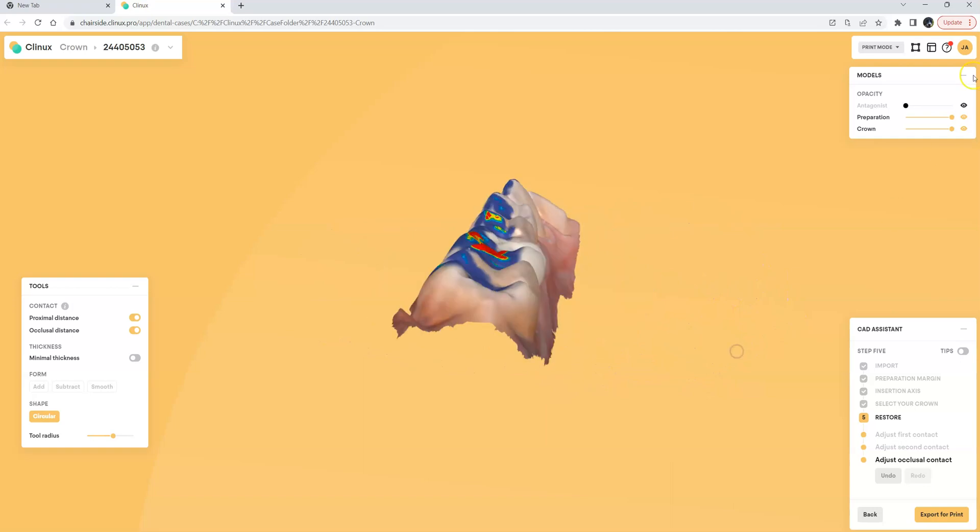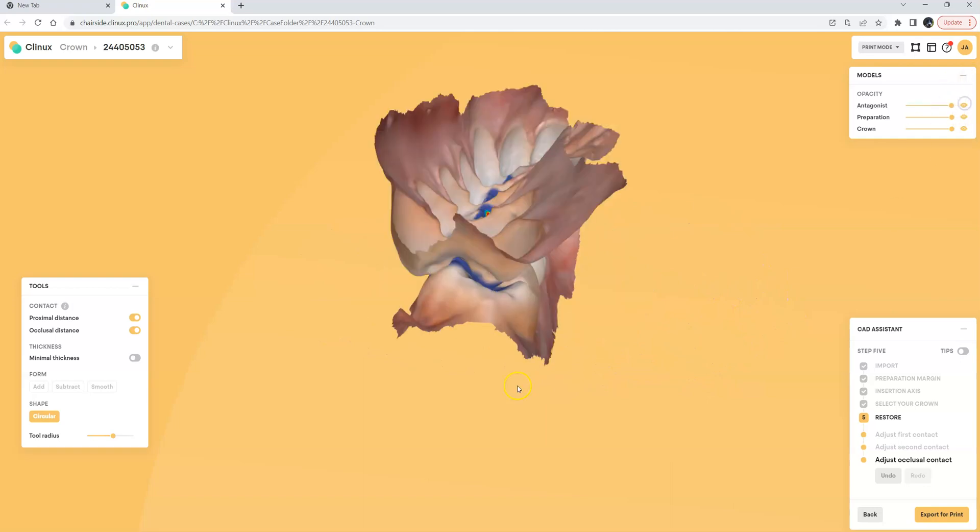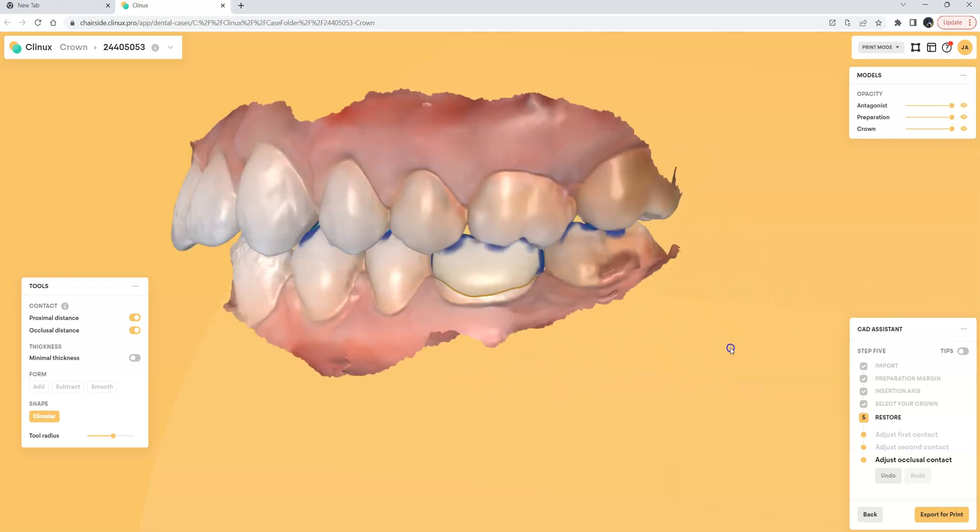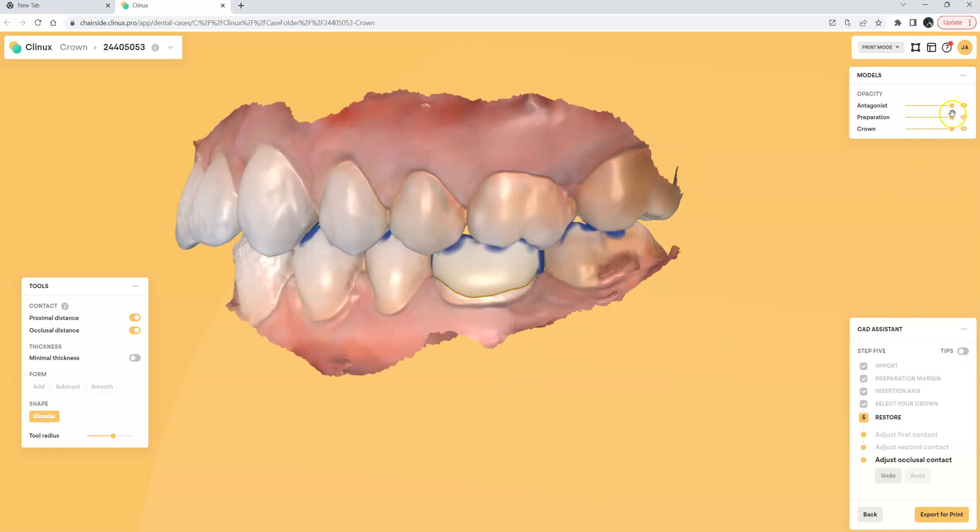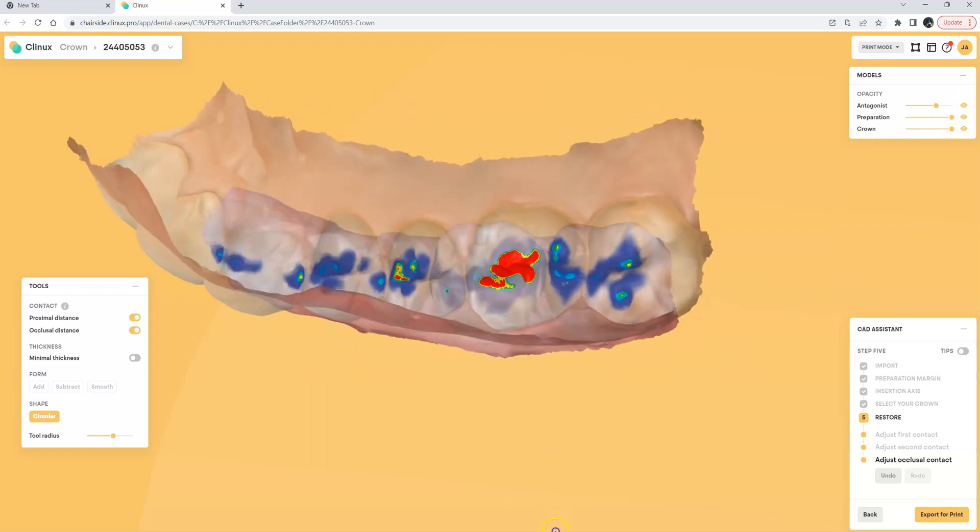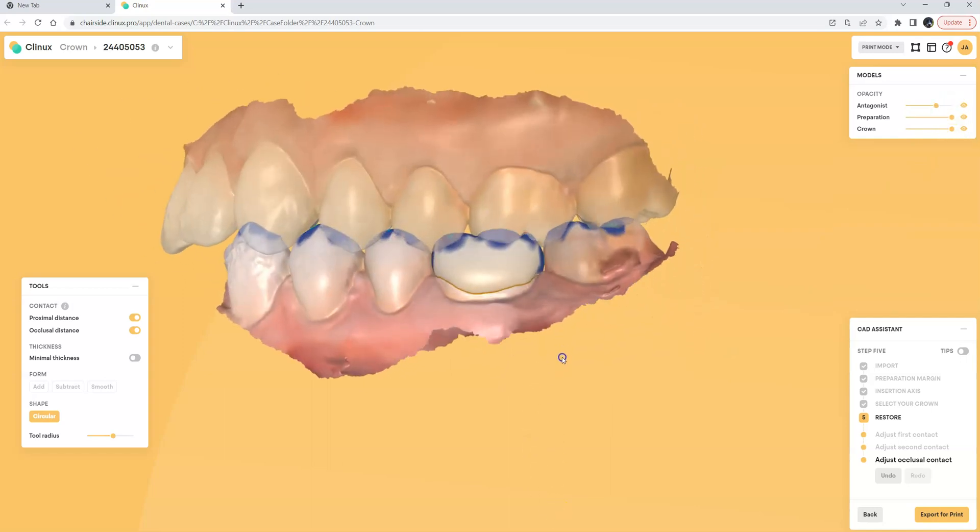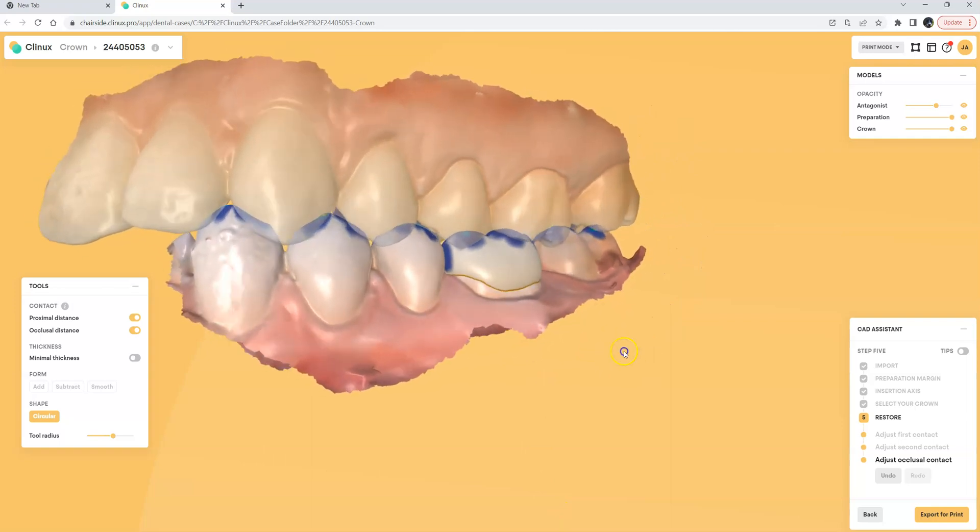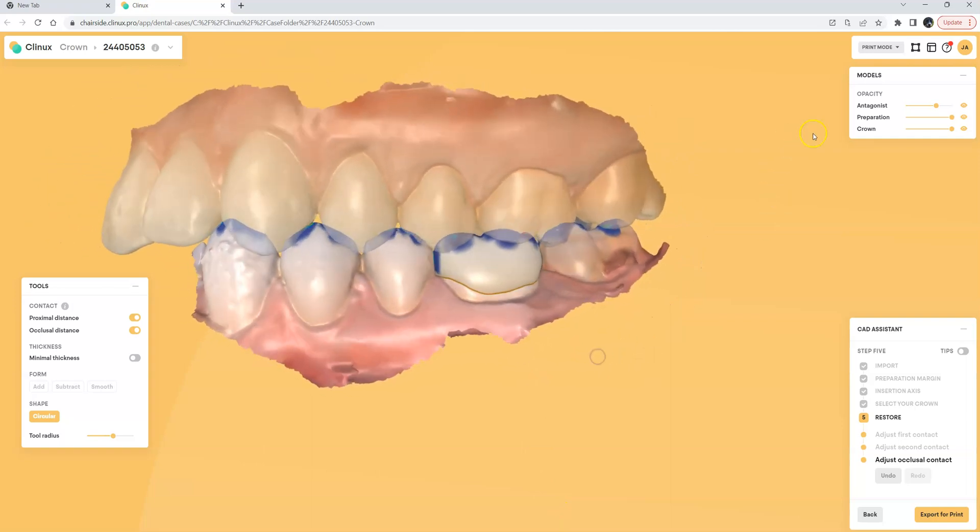I can certainly turn on the antagonist or the opposing arch model. I can certainly make that transparent and we can see what the occlusal contacts look like.